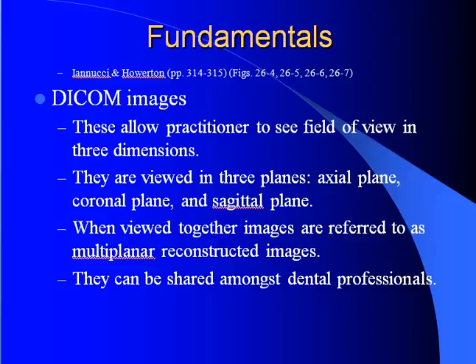These images allow the practitioner to see the field of view in 3 dimensions. They are viewed in 3 planes: axial, coronal, and sagittal. When viewed together, images are referred to as multiplanar reconstructed images. They can be shared amongst dental professionals.